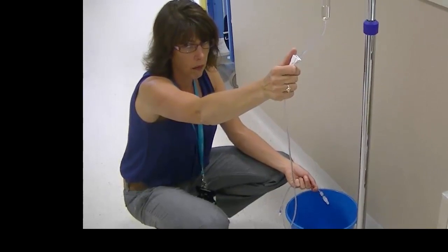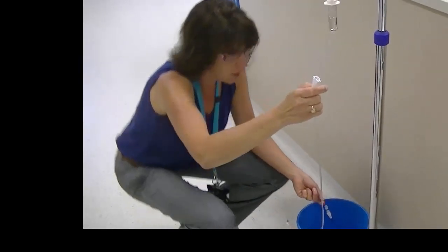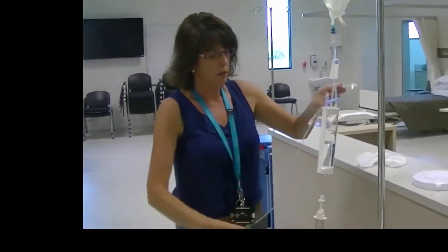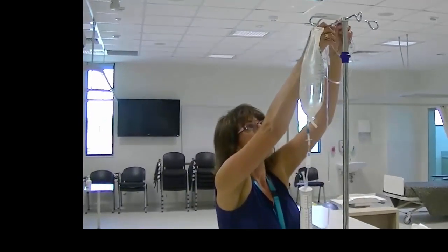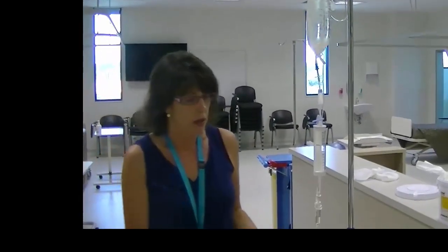Good, it's nearly there. All right, now I'll continue. So I haven't let go of the end. I'm going to coil the IV line up, just hook it up onto the IV pole so everything is protected. All right.